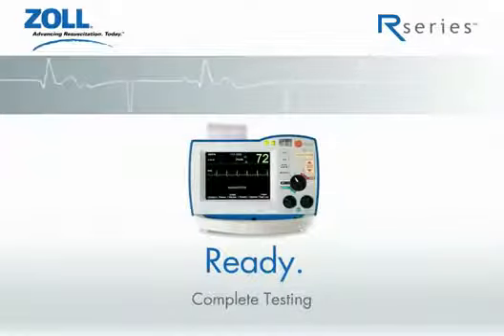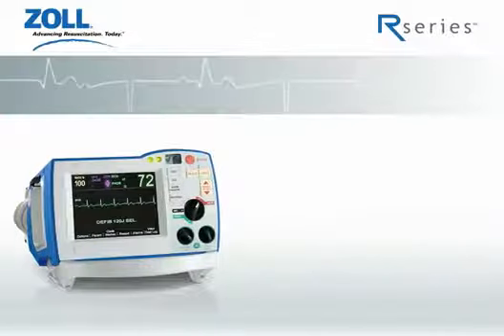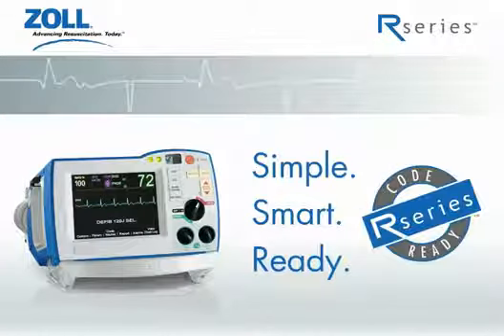Complete testing with no compromise means you can be confident each of the R-Series functions will be ready when you need it to save your patient. That's the R-Series. Simple. Smart. Ready. The world's first code-ready defibrillator.